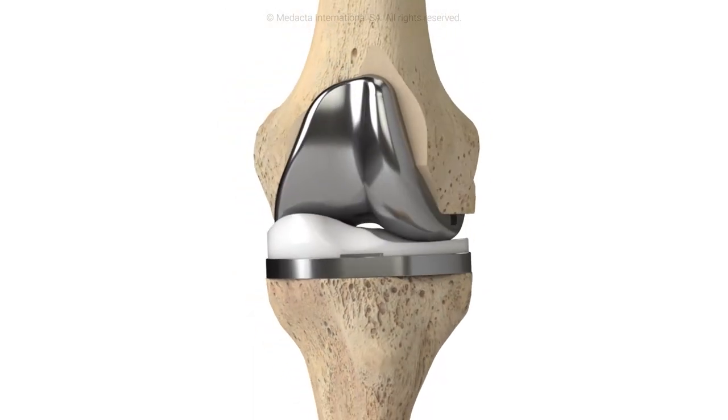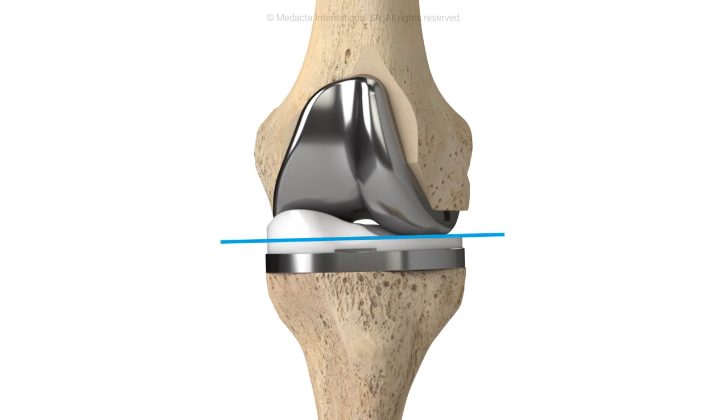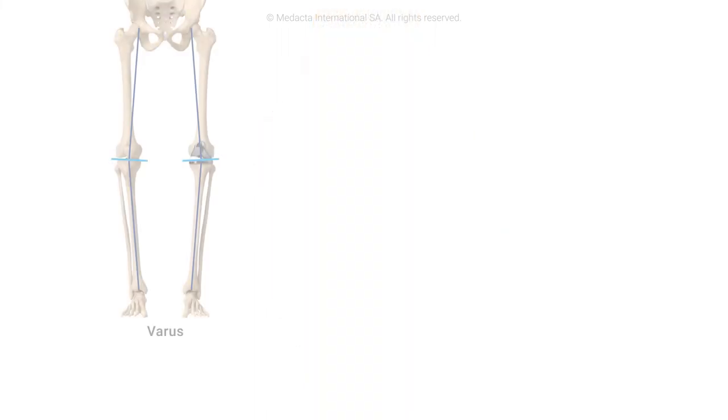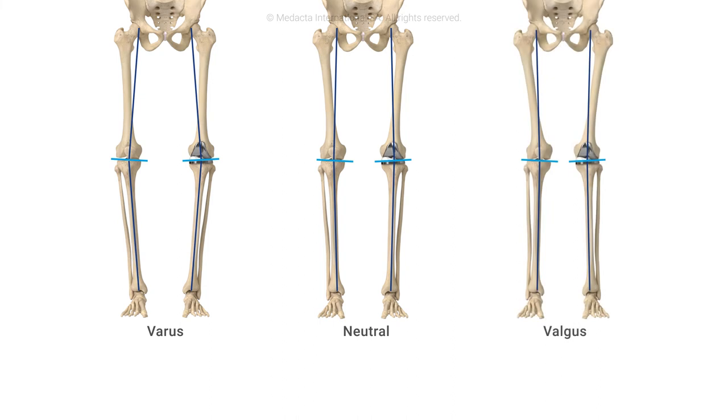Through anatomic resurfacing with no ligament releases, kinematic alignment restores the native joint line as well as the limb alignment of the patient for a truly personalized implant placement.